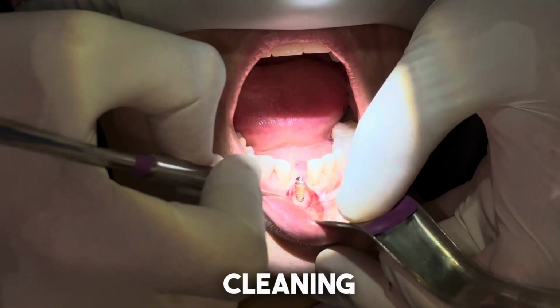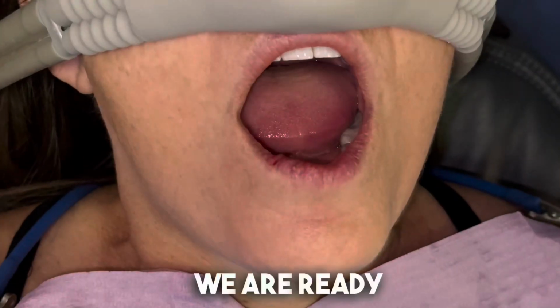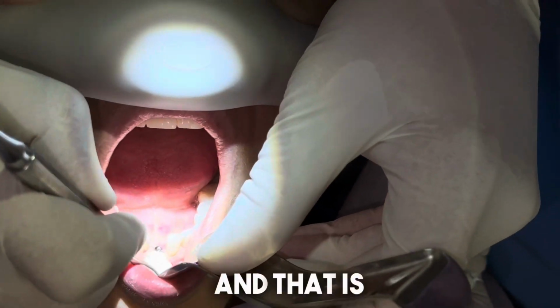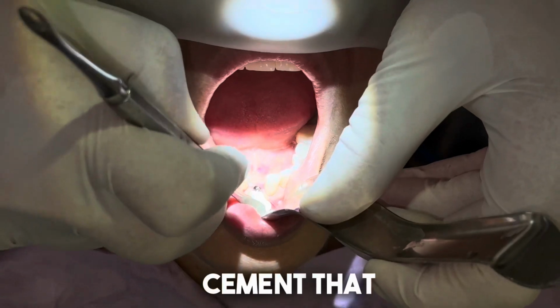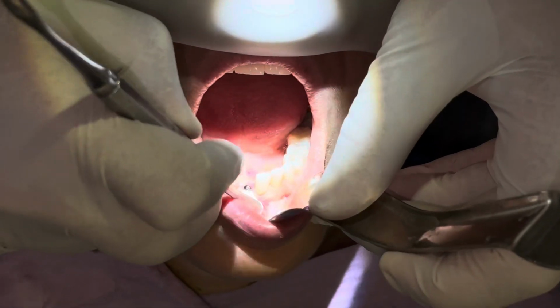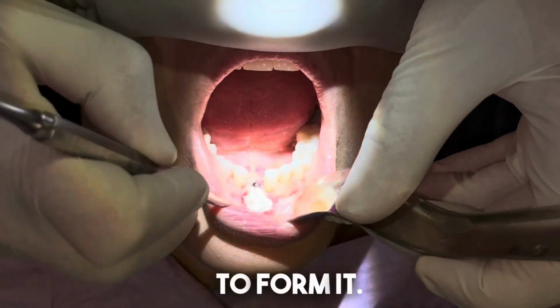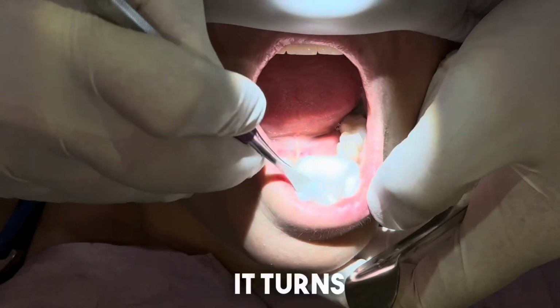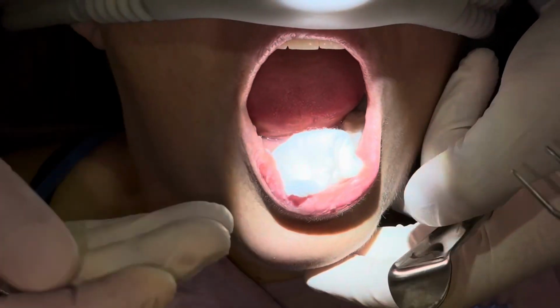So as we're cleaning things up around, we are ready to squeeze that powder in there, and that is the bone cement that goes on top. As you can see, we're going to form it. It's like a putty, and then with a wet gauze, it turns into a solid.